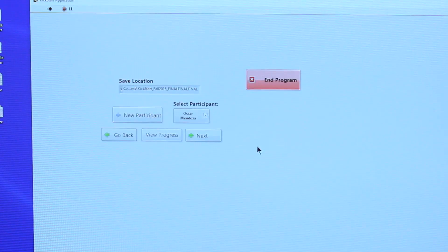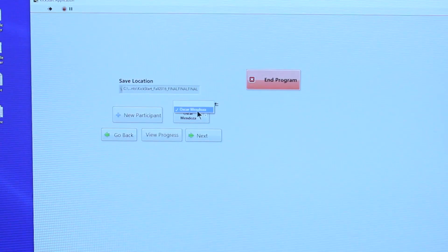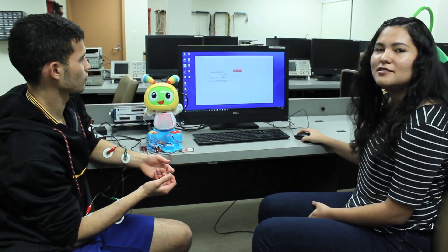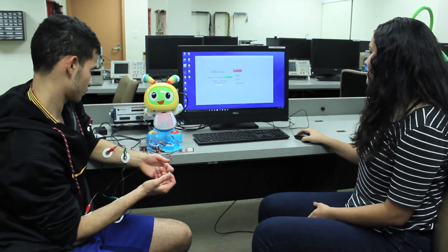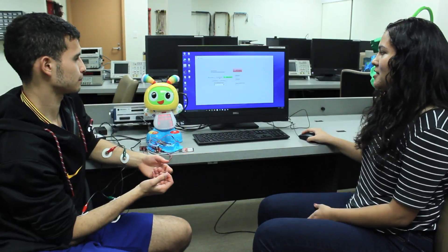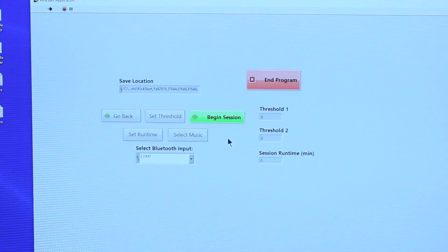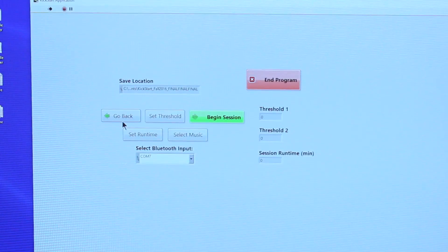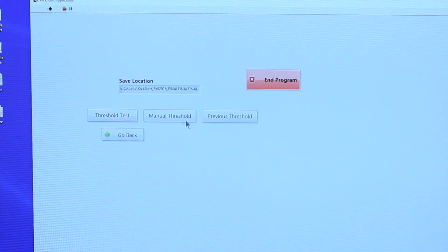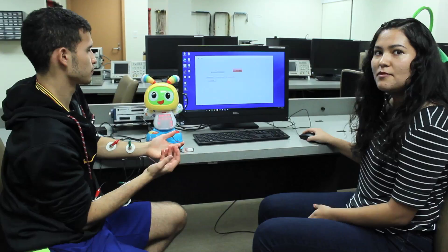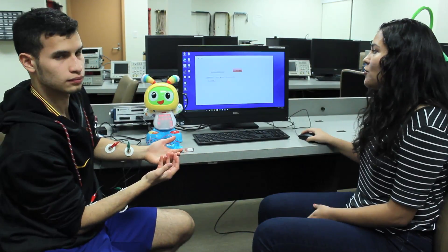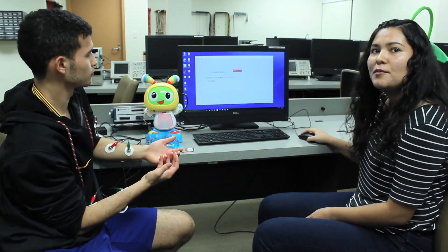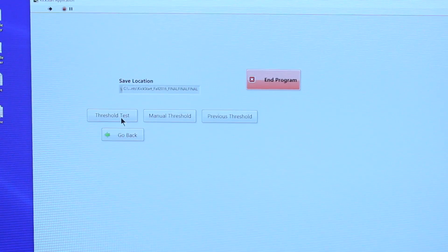We click next. The first thing you want to do is set the threshold. You can run the threshold test, use the previous threshold values, or if need be, you can manually set the threshold.